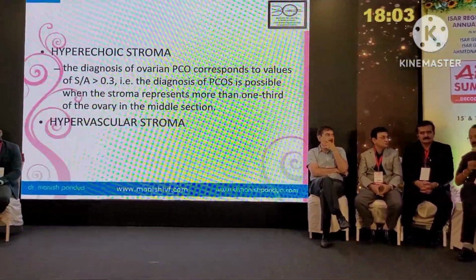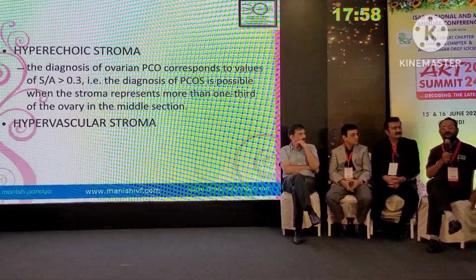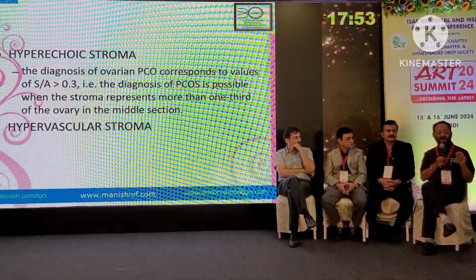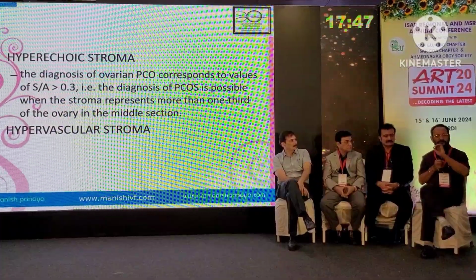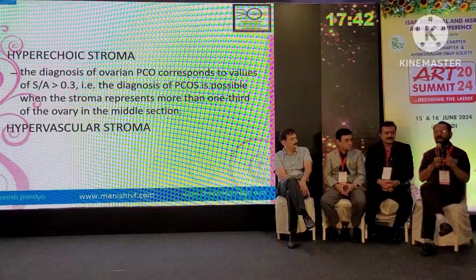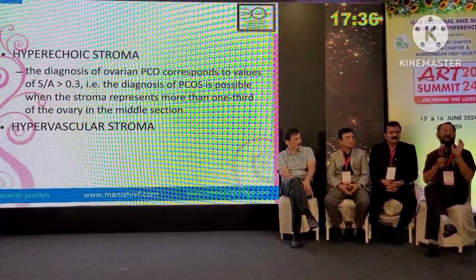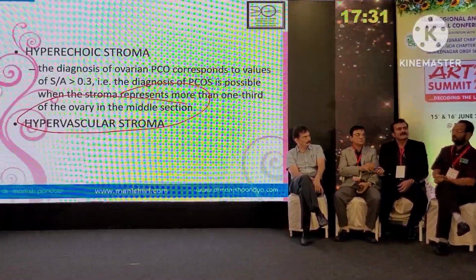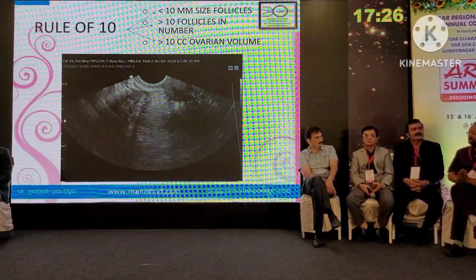Manish bhai, in my 33 years of practice, nowadays I have seen a lot of unmarried teenage girls with PCOS syndrome. The parents come with the complaint of obesity, later hirsutism and amenorrhea. So it has increased rampantly. It is very difficult. I ask them all to undergo hormonal reports. Most of the time the hormonal report is normal, but they are always symptomatic. If you see the uterus, there is always hypervascular stroma on the ovary. The ovaries are thicker as well as multicystic, and that's why there is the rule of 10.